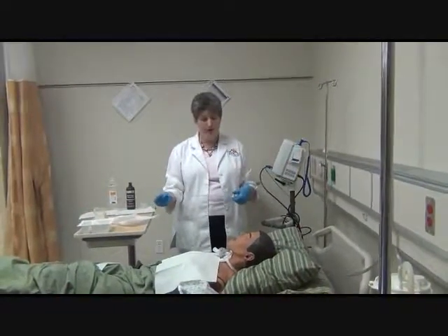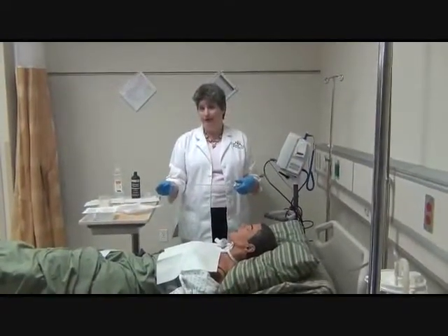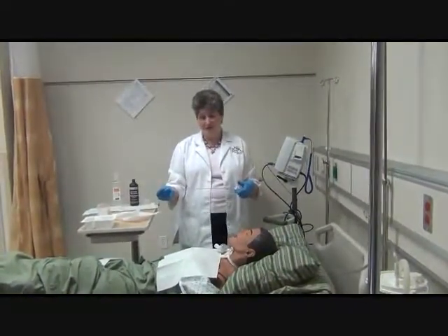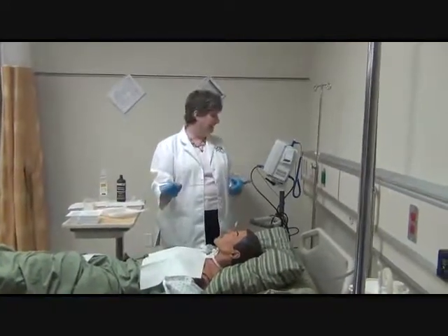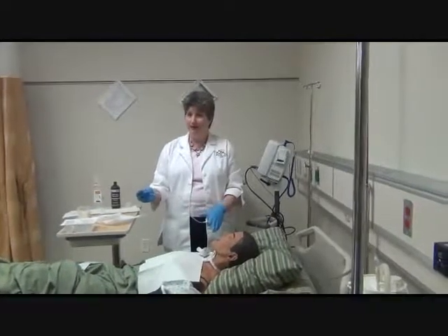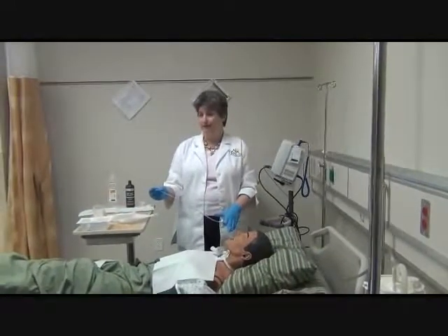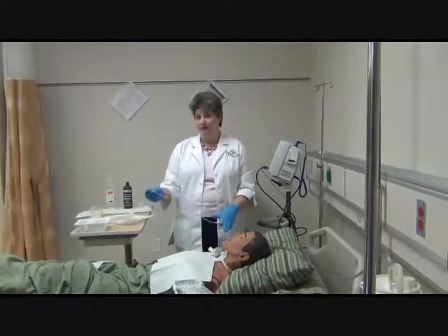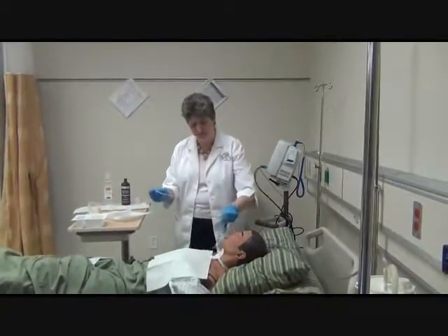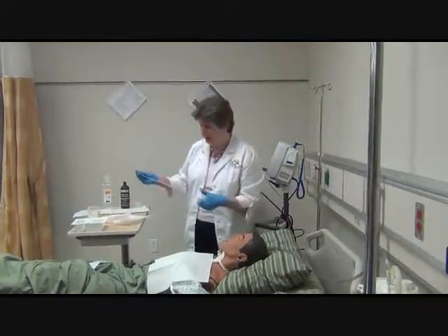And again, you're going to do that monitoring your patients. Some patients will be fine to go in a minute. Others you may find you have to sit here, let them catch up and take 5, 3 minutes, whatever. You're going to judge it by your patient's SAT levels. And again, I've suctioned people where actually going down stirred up some mucus clots, and I needed to get back down quicker than that. So again, you've got to monitor and judge your patient. But general rule of thumb is at least a minute.